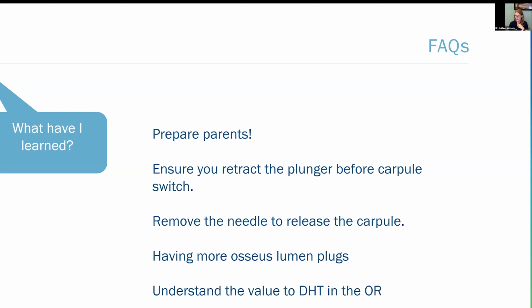Now, if you're on your game, you'll see the pressure indicators when they get to 3, or in the SleeperOne, it starts rapidly. You're like, something's not right here. Take your foot off, try again, reposition the needle a little bit. And if all else fails, take it out, switch the needle, and go back. Most of the time, you'll drop right back into the spot you were in, and all is well.